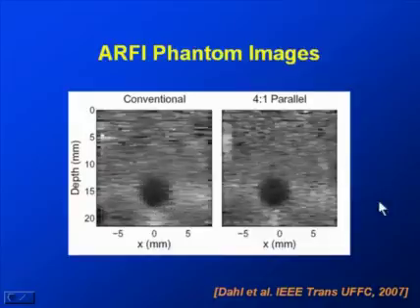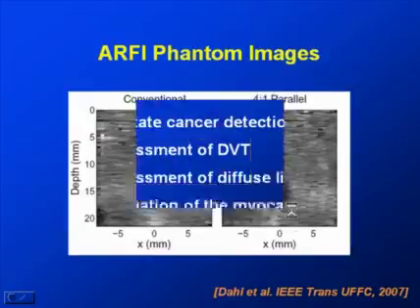But here is a 4-to-1 processing scheme that was proposed very recently in this paper in 2007, and you can see the improvements in lateral resolution relative to the conventional RF image here.